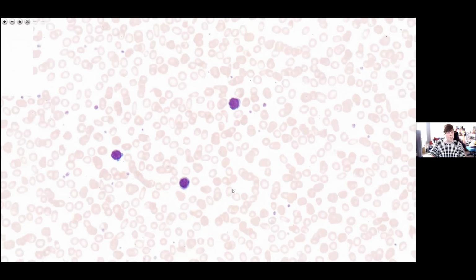There we go. So again, looking at the size of the red cells first, if we're comparing to the size of a nice small lymphocyte, they are probably a little bit microcytic and not like the first one where they were markedly microcytic, but these do look a little bit smaller than usual to my eye. They are smaller than that nucleus, certainly. And the area of central pallor of them, apologies, it is a pale film, but there is more central pallor. It's more than 1/3 of the cell, and therefore they are also hypochromic.